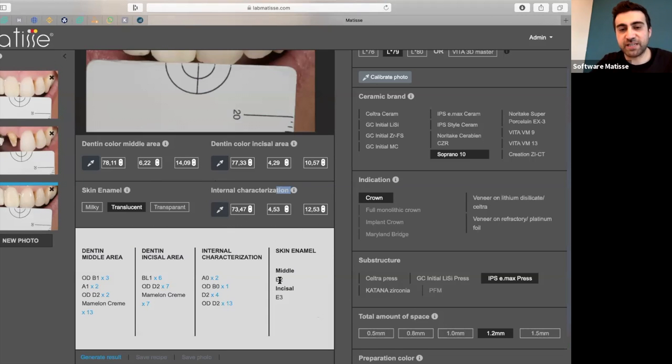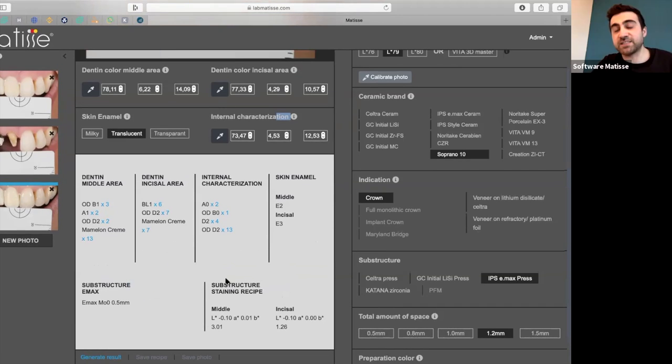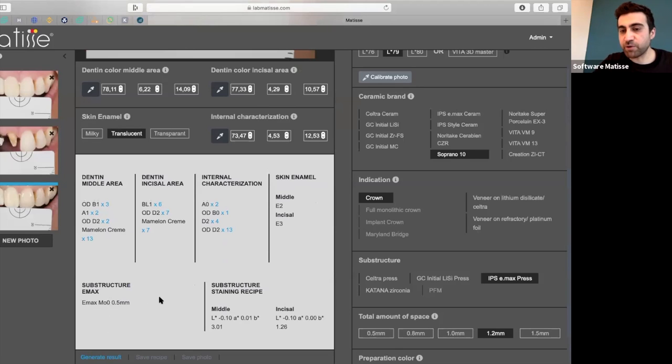So this is the first thing, right? Getting the recipe. This is the first stage. We got the recipe. So now let's check what to do with it. What are the other steps? The next stage: we need to understand what to do with this recipe. So you order your framework according to the advice. We get the framework as recommended.